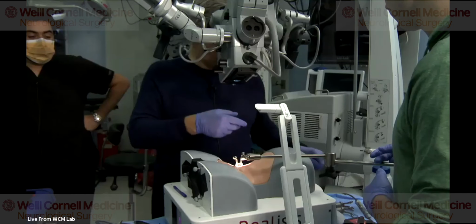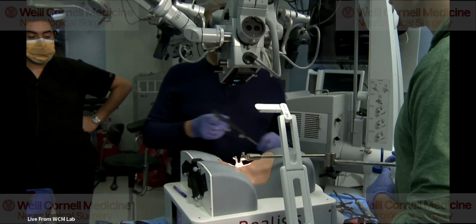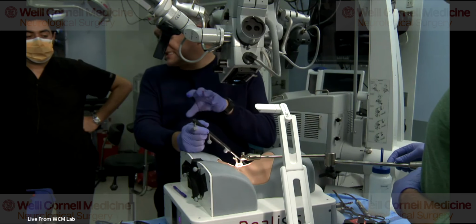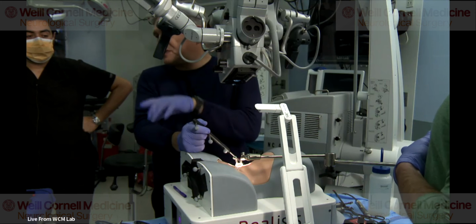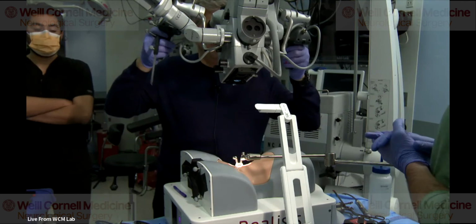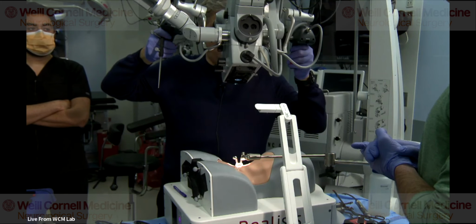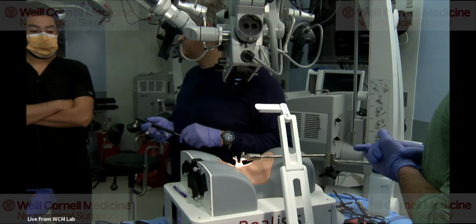They're asking, how do you deal with the bleeding? I think you have a very established routine. Yeah, the bleeding during the approach. The most important thing here is really the careful dissection under the microscope. This is totally different from the lumbar spine. In the lumbar spine, you just dilate, right? You put in your big dilators. Here, you dissect under the microscope with Metzenbaum scissors, and then if there's bleeding, you take care of it while you're going deeper with the bipolar coagulation.